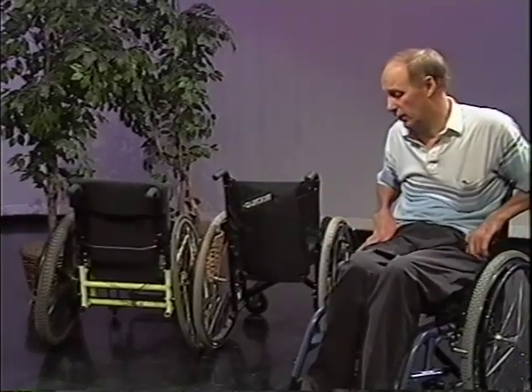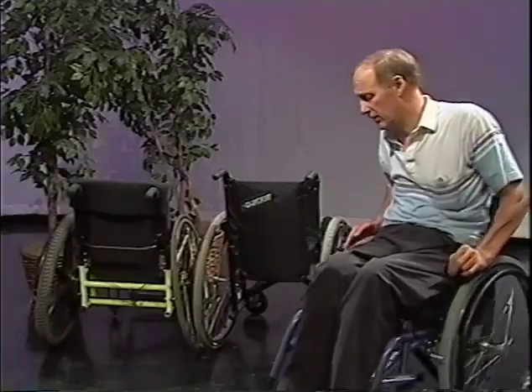Camber is simply a way to stabilize the chair and give you a little bit of ability to corner better. The other thing that I like about camber, when you consider pushing, if your wheel is perpendicular to the ground, when you push, you have to push perpendicular to the ground, which is not quite ergonomically as nice as you'd like it to be.